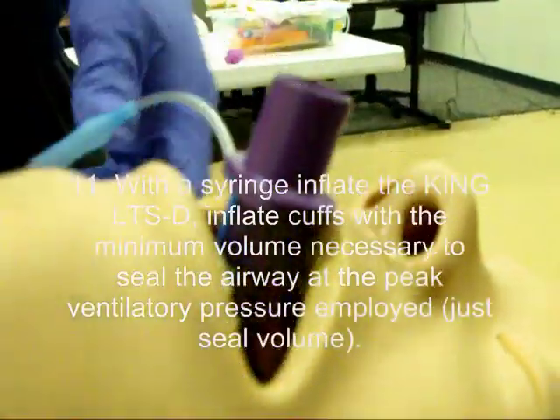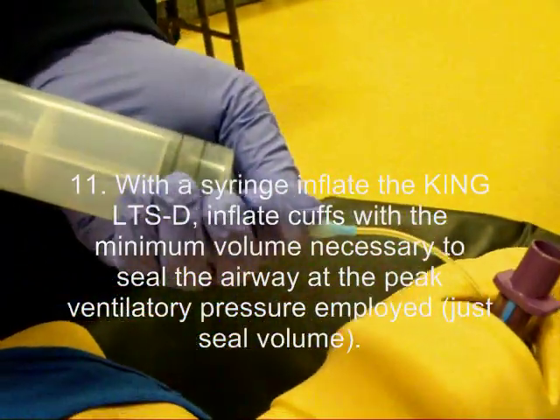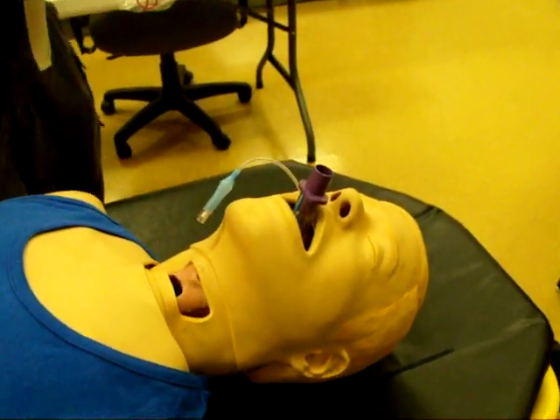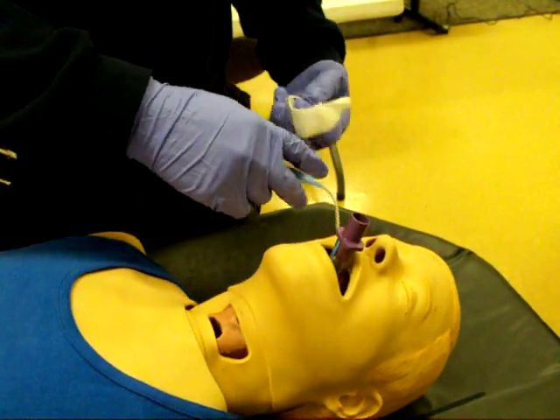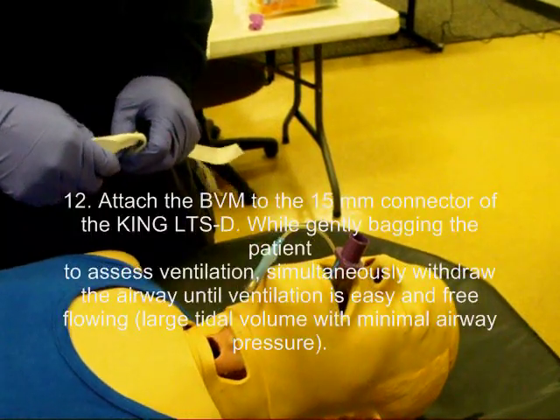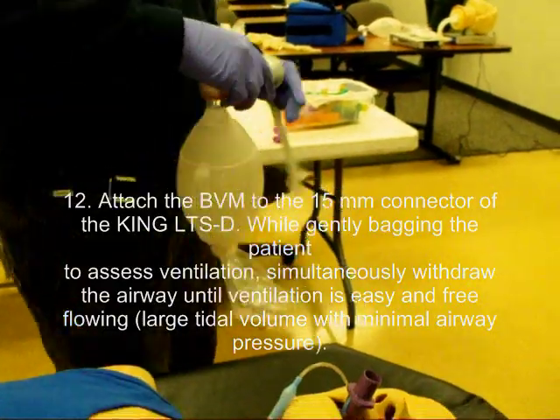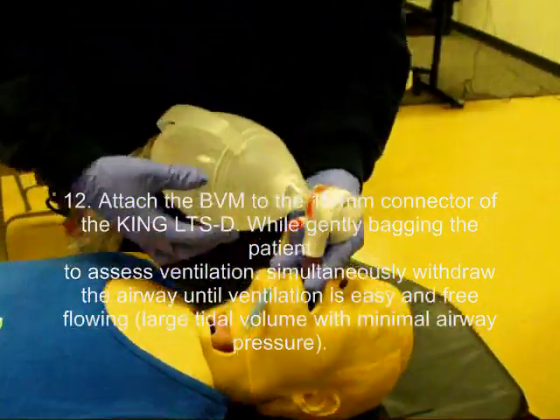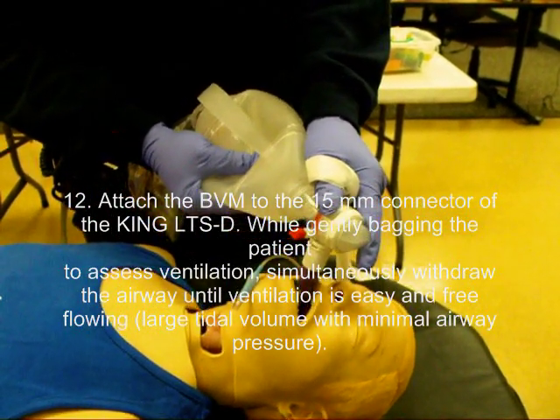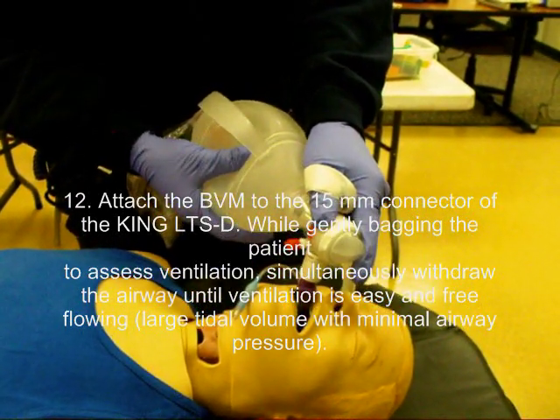With the syringe, inflate the airway cuffs with the minimum volume necessary to seal the airway at peak ventilatory pressure. In this case, 60 cc's of air, or one full syringe, with the included syringe with the King airway kit. Attach the BVM connector to the King airway. While bagging the patient, simultaneously withdraw the airway until ventilation is easy and free flowing.